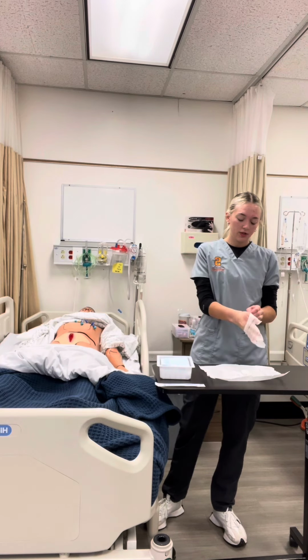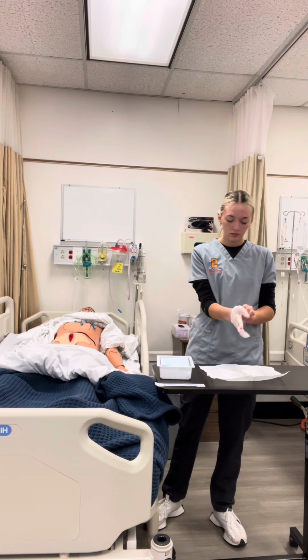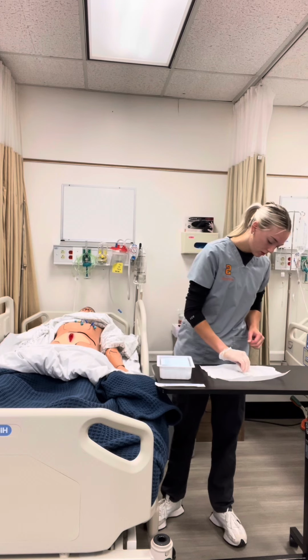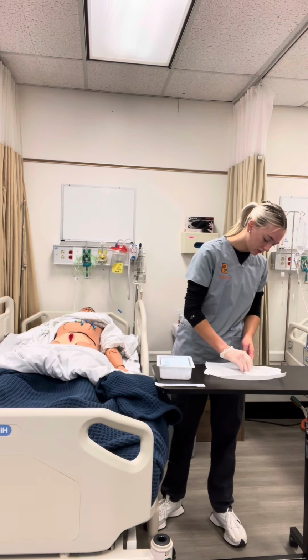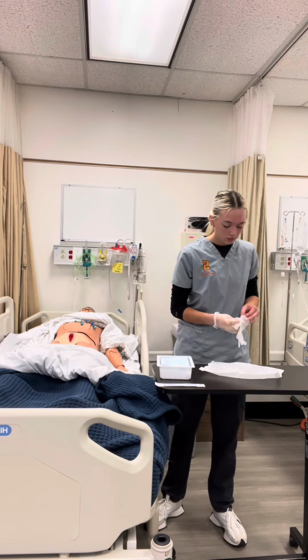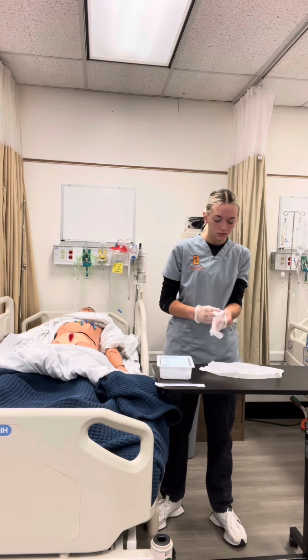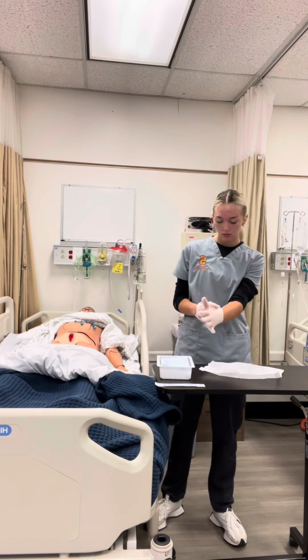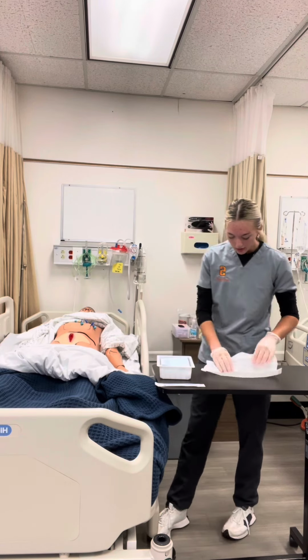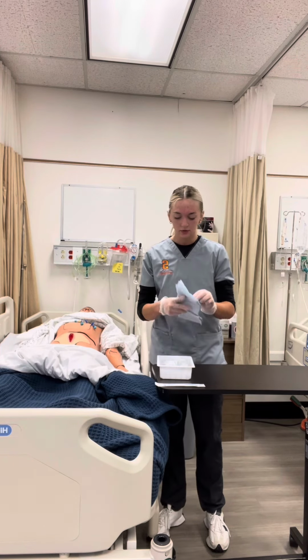I'm going to be really careful here not to touch the outside of my gloves. Okay. All right, perfect. So now I'm just going to dispose of that and lay out my sterile field.